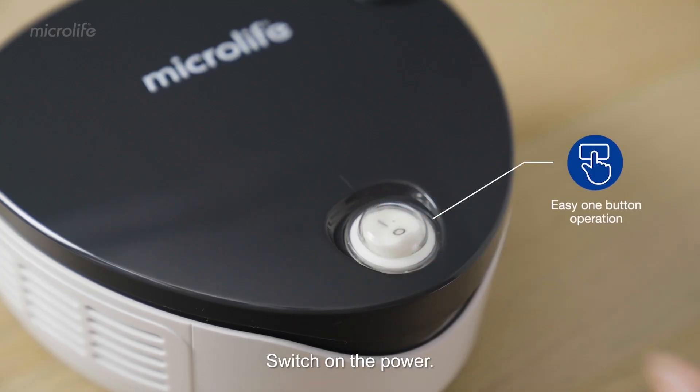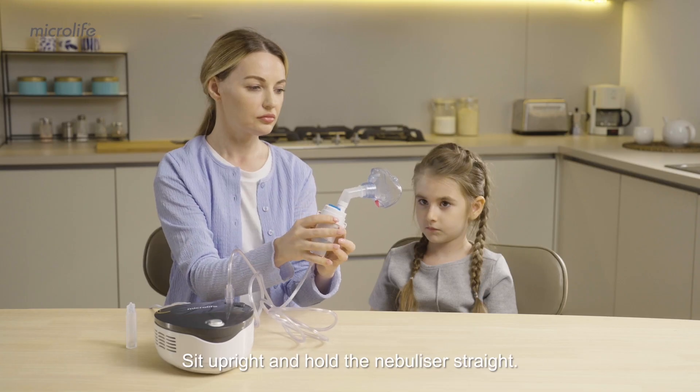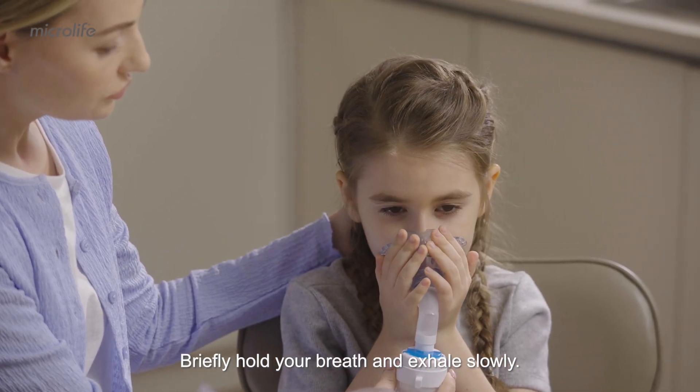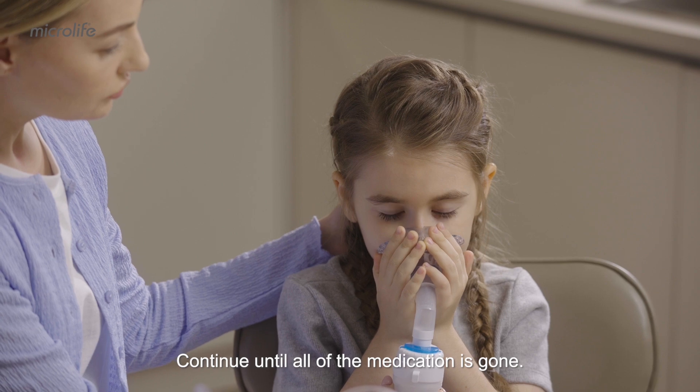Switch on the power. Sit upright and hold the nebulizer straight. Briefly hold your breath and exhale slowly. Continue until all of the medication is gone.